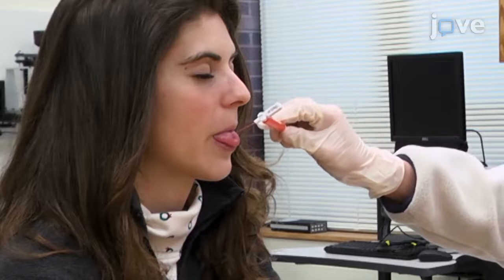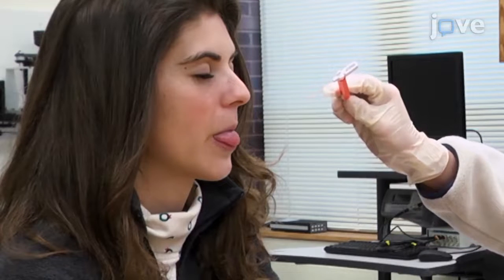The purpose of using this technique is to understand how point pressure sensation changes across the adult lifespan, because disorders can cause changes, but so can age and lifestyle choices.